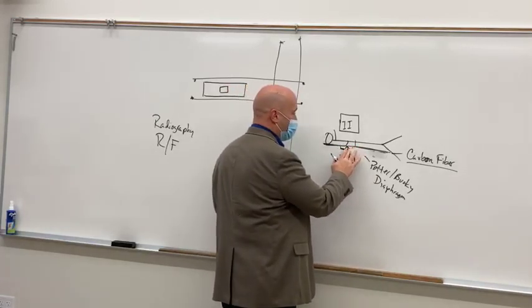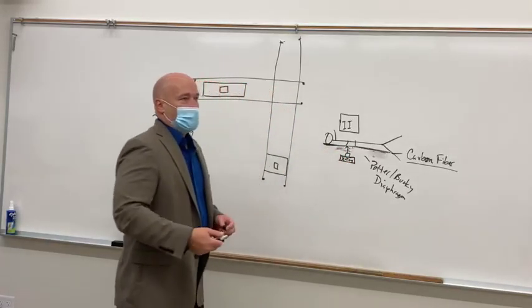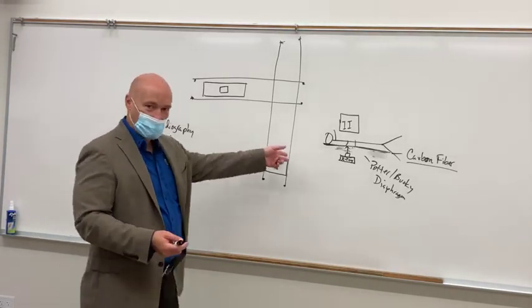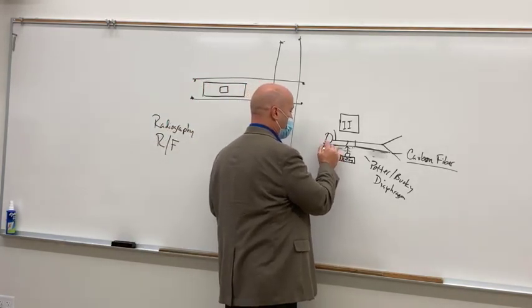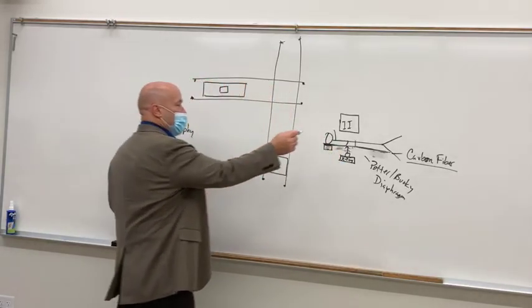You don't see that quite as much as what you would think you would. If you go to surgery and you do a cysto case where they don't do a whole lot of moving the patient on the table, you'll see that. But in most of your diagnostic departments, you don't. It's either going to be at the top of the table or at the bottom of the table whenever you're doing fluoro. So anyway, back to the image intensifier.